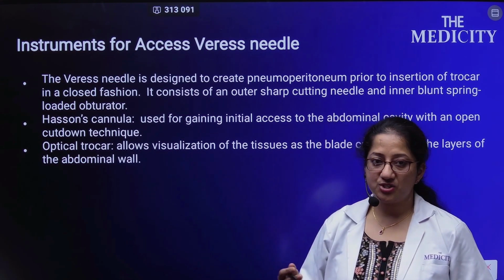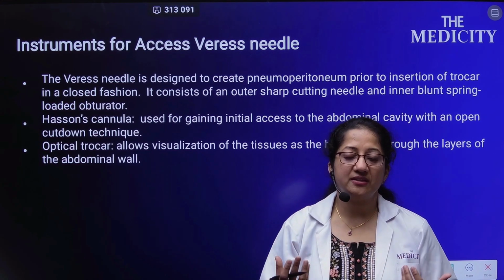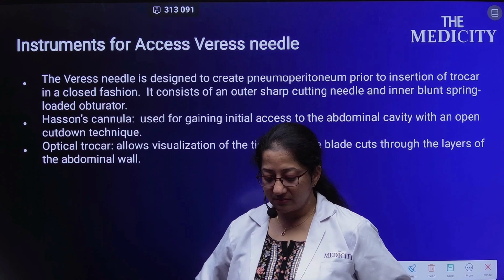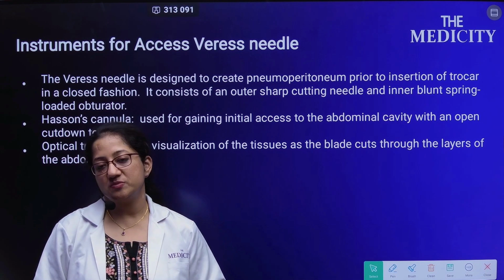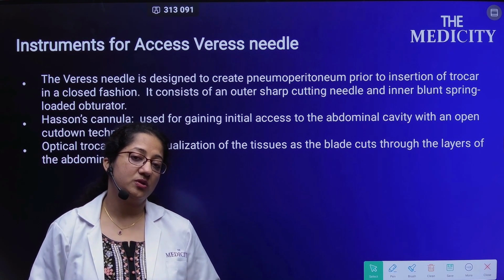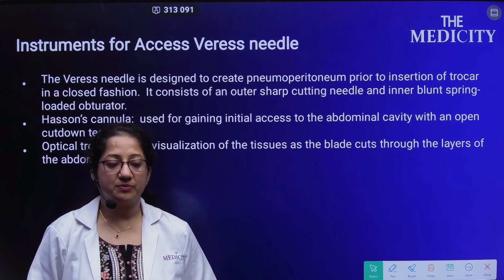Another advantage of the Hassan's technique is that we of course know what we are cutting, and there is very minimal chance of any bowel injury, because sometimes there can be some adhesions of the bowel in the area where we are going, which we don't know. Even in patients with no previous surgeries, there can be abdominal adhesions and you can inadvertently go into a vital structure. So then it becomes a problem for the patient.